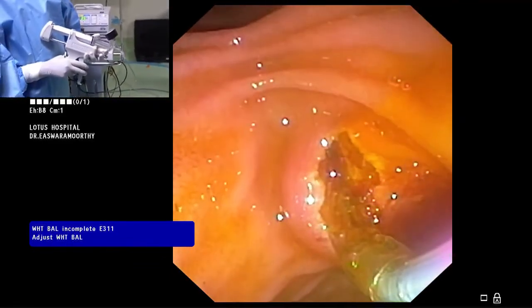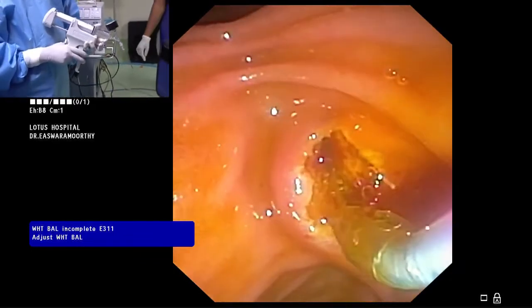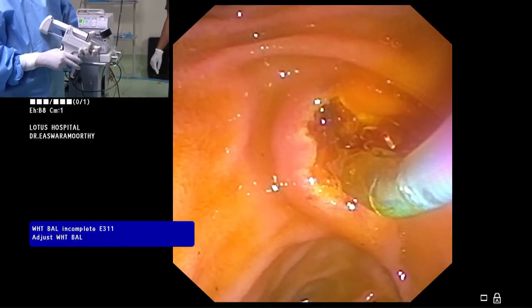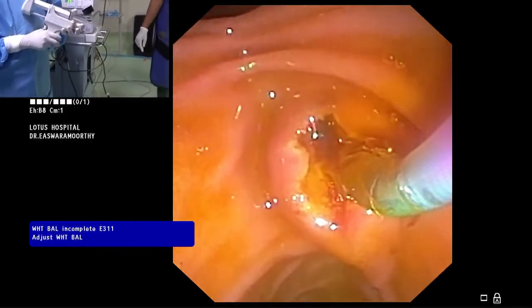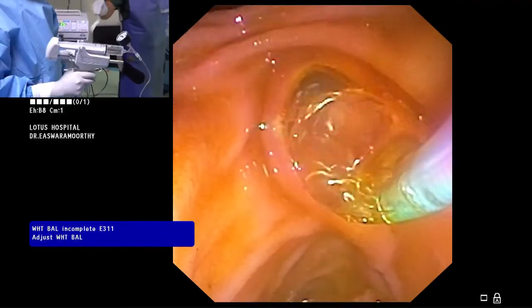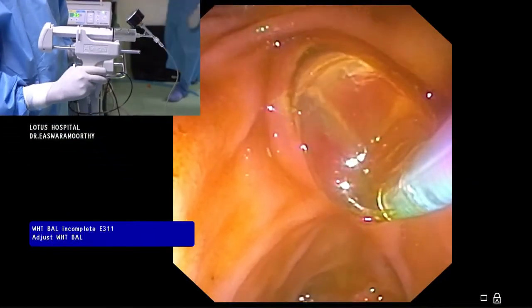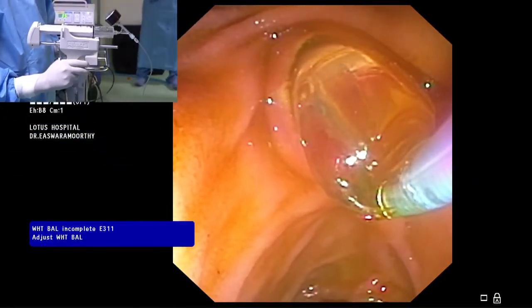You can see a little bit, about a centimeter of the catheter is visible there. In that position, you ask them to inflate, and you show the hand. She is using a special inflation gun. With that, she is inflating, and this causes quite a uniform dilatation of the sphincter.